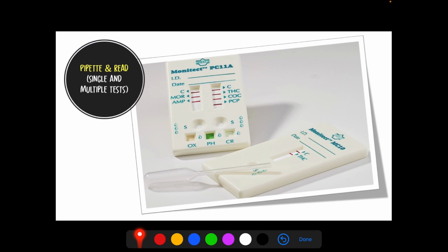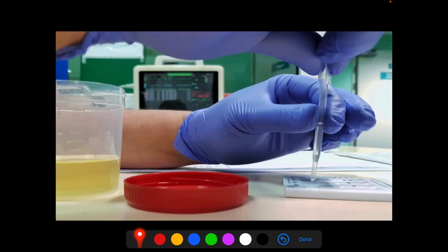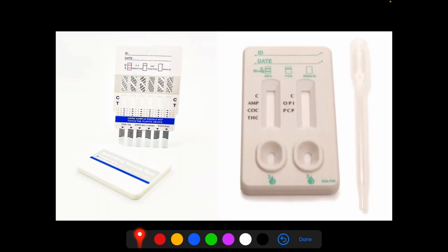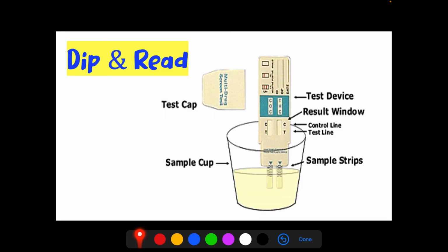This one is also pipette and read, but this one is a single kit. This one is for multiple tests. Also this one, that's the procedure of using that kit. And also this one, for multiple tests also.